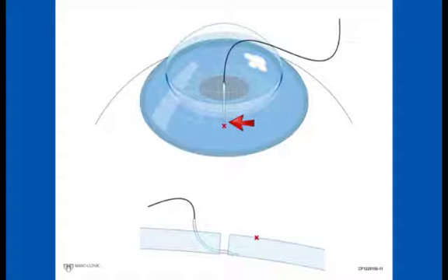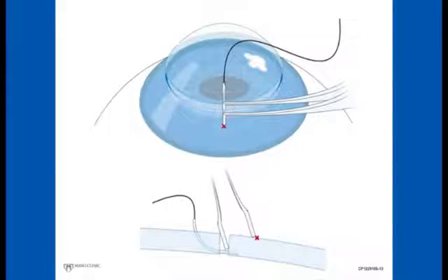Why don't we just drive through? Because the host has to be stabilized with the forceps before the drive to make sure the host doesn't wobble and lead to a non-deep and or non-radial needle passage.